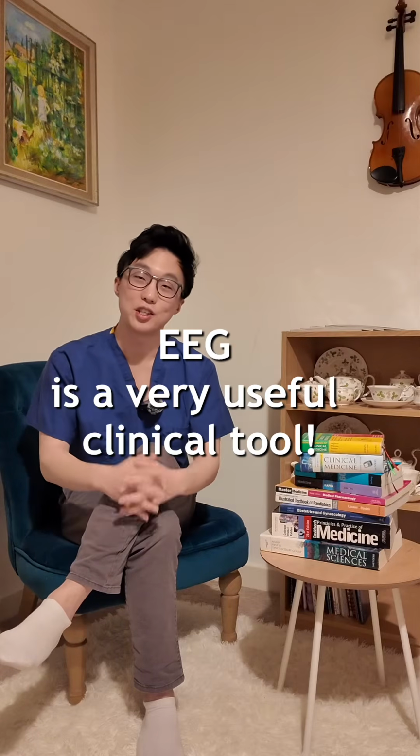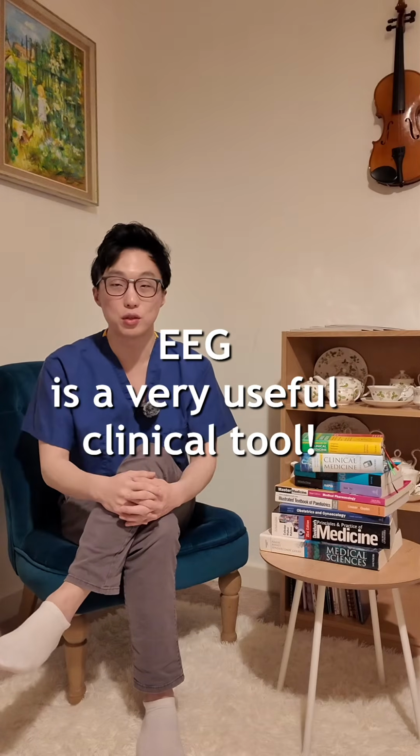Electroencephalogram, also known as EEG, is a very useful clinical tool where electrodes are placed on the brain to measure the brain wave and the brain activity. Initially, when I was a med student, a junior doctor, SHO, and a junior registrar even, I thought EEG use was limited to detecting seizures, status epilepticus, and non-convulsive status, but it has a lot more use than that.